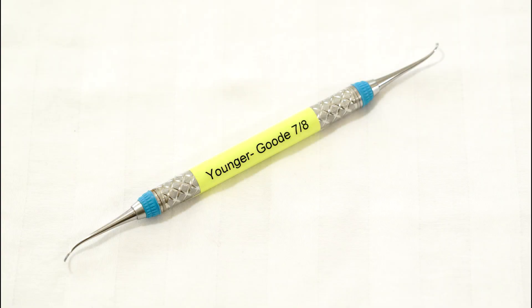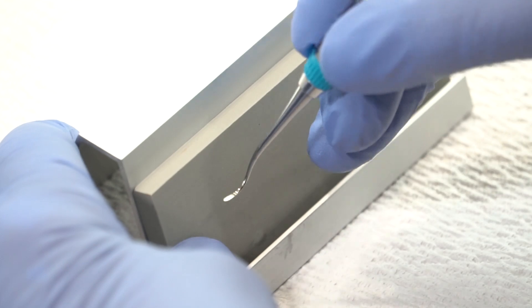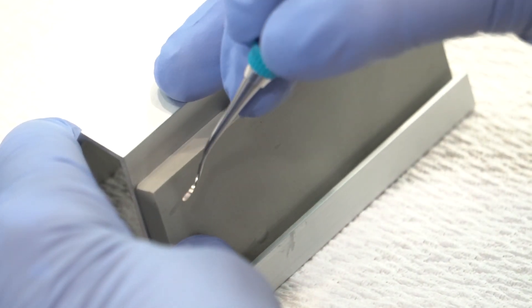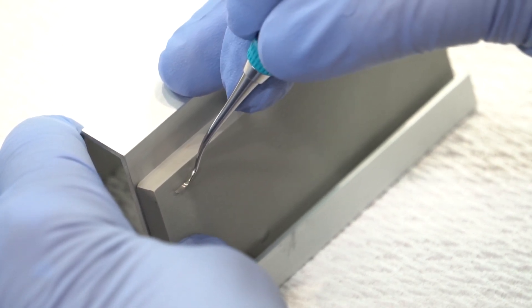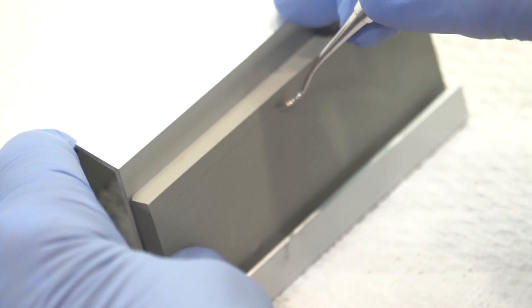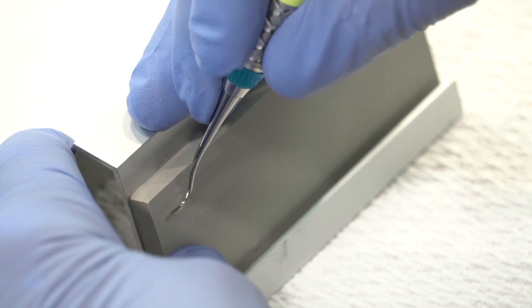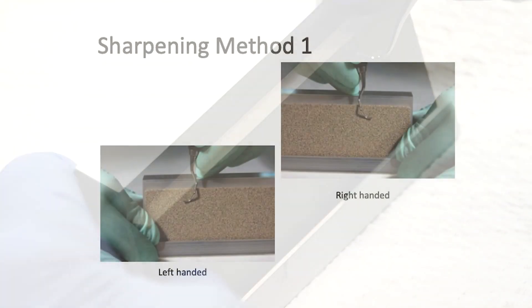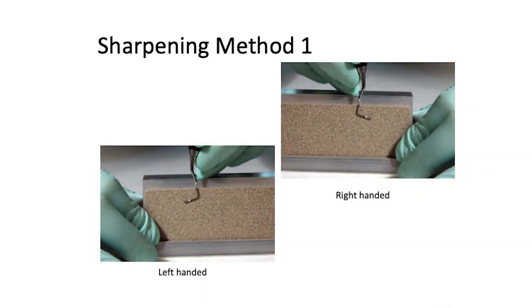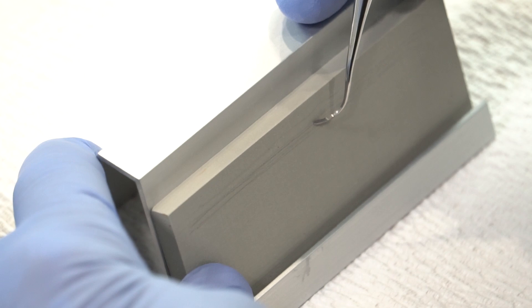With the Younger Good Universal, the same principle applies: as long as the face is parallel to the tabletop, the stone is at the right angle. Method one: heel third, middle third, toe third, toe. Method two: face is parallel, fulcrum on the leg, heel third, middle third, toe third, toe.